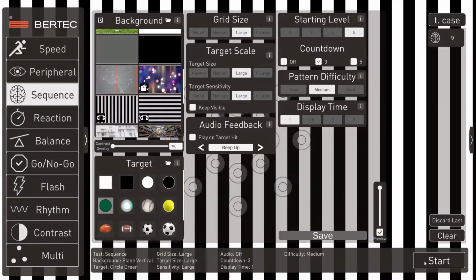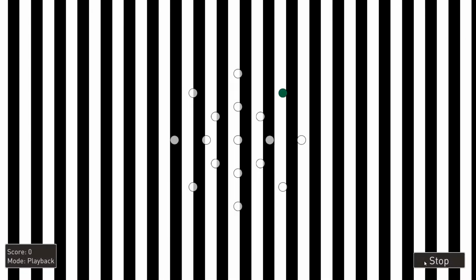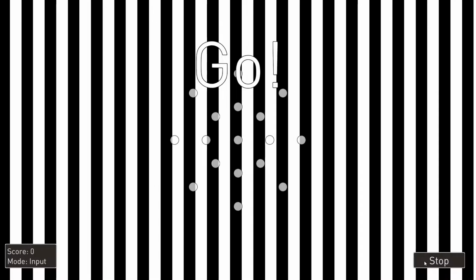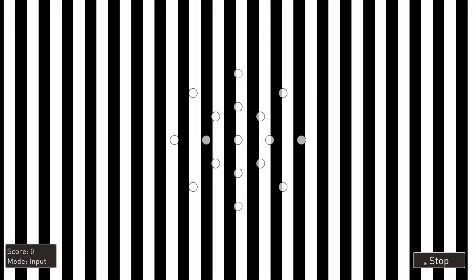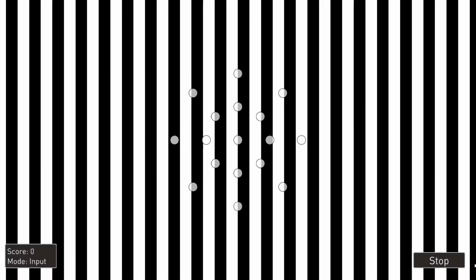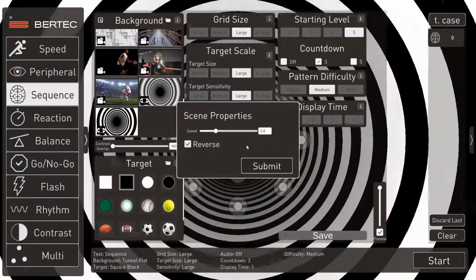I just wanted to demonstrate it for you because I want to get up to the vestibular stimulations. Because as everyone knows, when we add a vestibular OKN stimulating stripe, it has an effect on so many things. It can affect cognition. It also can affect short-term memory because we're doing more tasks. And this multitasking is just more difficult after a traumatic experience like stroke or concussion.